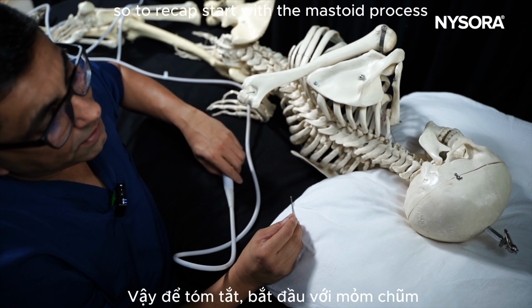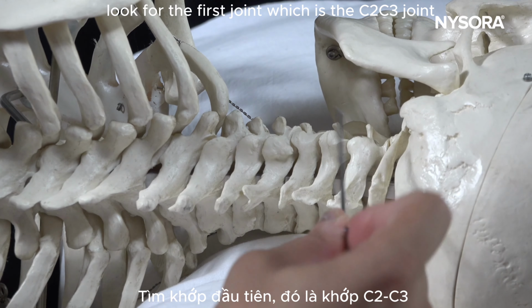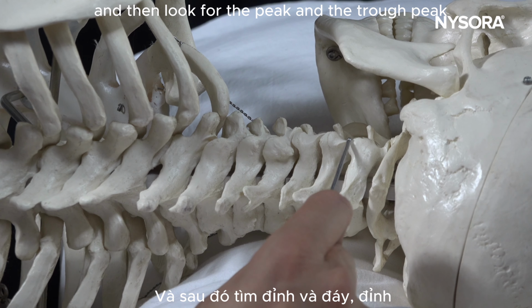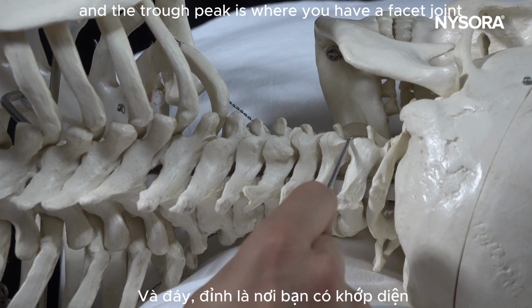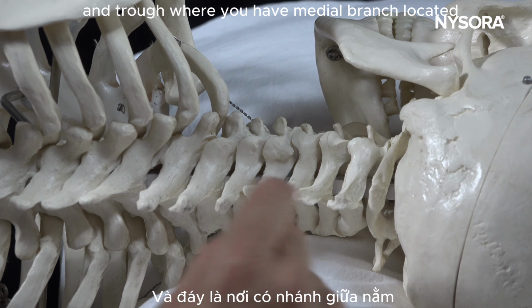So to recap, start with the mastoid process, move down, and look for the first joint, which is the C2-C3 joint. Look for the third occipital nerve, and then look for the peak and the trough, peak and the trough, peak and the trough. The peak is where you have a facet joint, and the trough is where the medial branch is located.